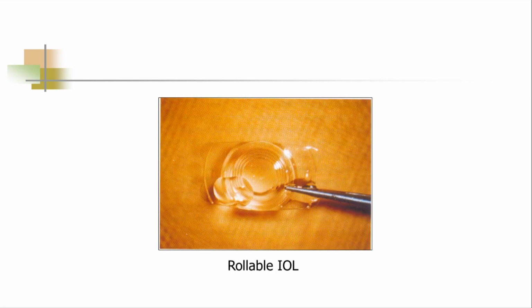And as the 1 millimeter barrier was broken, the rollable IOL came. This IOL is suitable for implantation in the phaconet technique through a 0.9 mm surgical wound. This is the most modern advancement in small incision cataract surgery, and complete phacosurgery through the two side ports is possible in this technique. This IOL has a thickness of 100 microns and is available in powers ranging from plus 30 to minus 30 diopters.